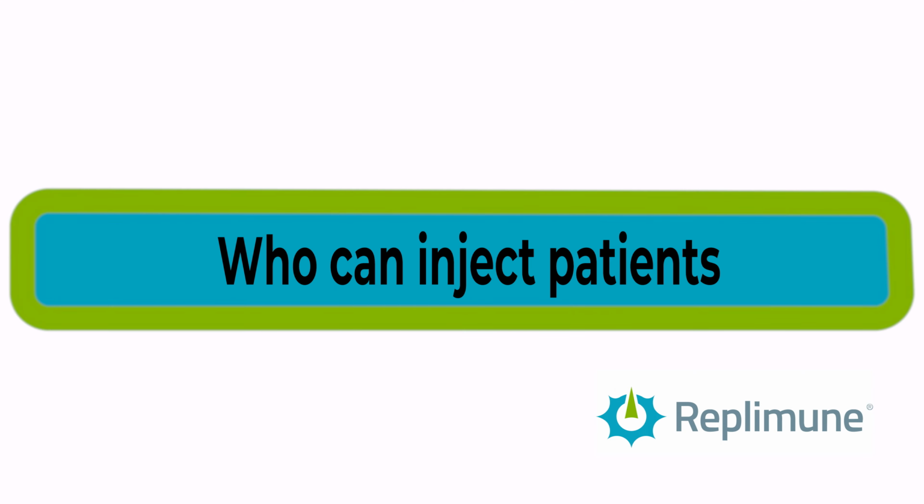After the patient leaves the room, we wipe down the bed with a Cavi wipe or a sanitizer wipe. We wipe down any surfaces that were used with the virus, and then we're ready for the next patient as soon as that dries. So we usually schedule them in half-an-hour blocks. Patients in the room for about 10 minutes. The injection takes about 5 minutes. Wiping down and preparing for the next patient could take about 20 minutes, and then we're good to go.